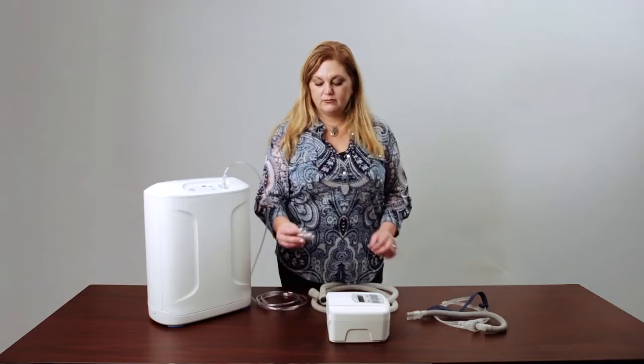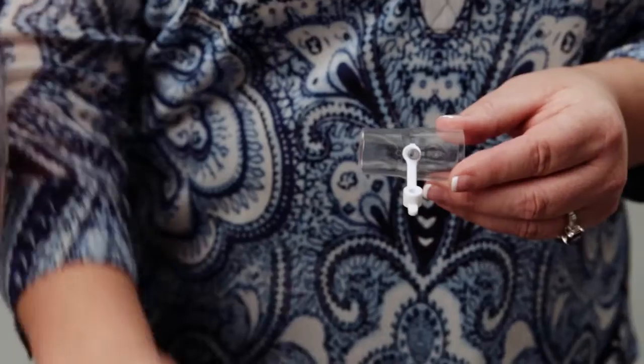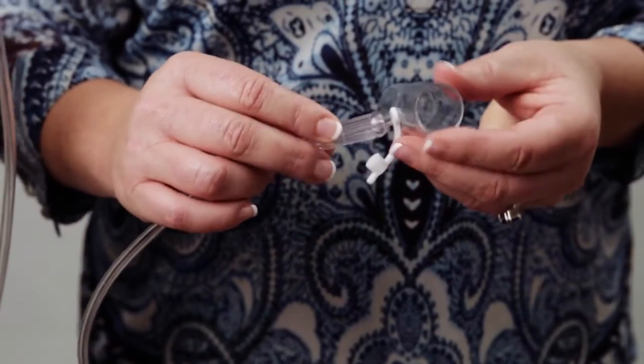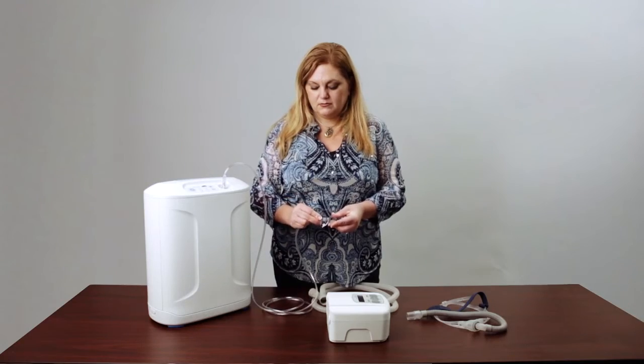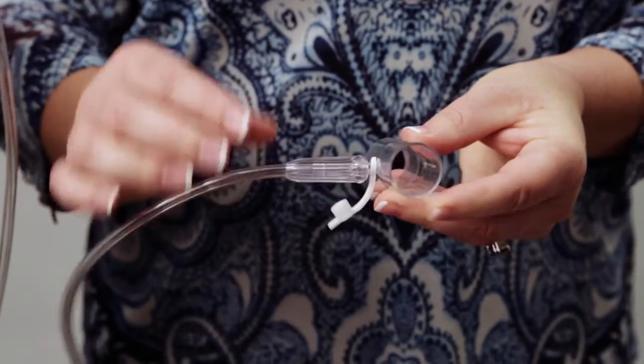With the oxygen turned off, attach the oxygen bleed-in adapter to the oxygen supply tubing. The oxygen supply tubing connects to a small opening at the base of the T-shaped adapter.